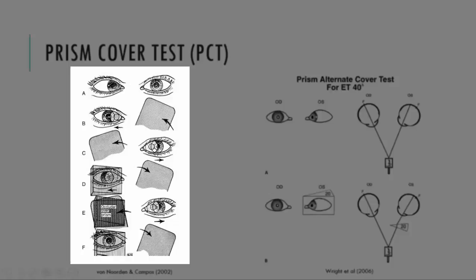And then we proceed to do an alternate cover test. So you can see here, the prism is over the right eye, cover is over the left, and then it moves over to the right, and then over to the left. So we're doing that alternate cover test. It is important that during the entire test, the patient remained dissociated, and that you do not allow the patient to be binocular during the PCT. Now, during testing, what you need to do is observe the eye under the prism. And what you're looking for is neutralization of movement, or what we call the null point. You will find a prism which results in the eye under the prism no longer moving to take up fixation.